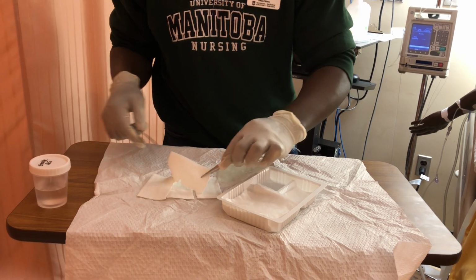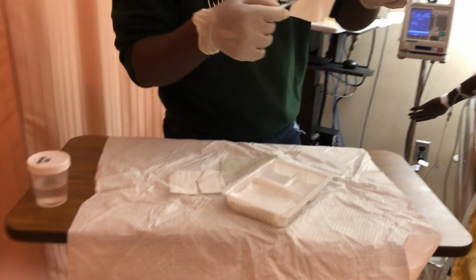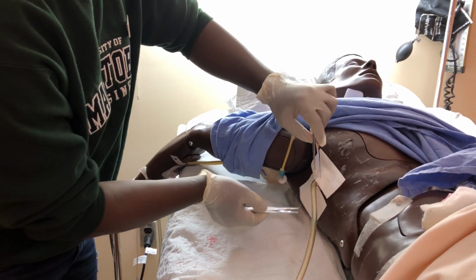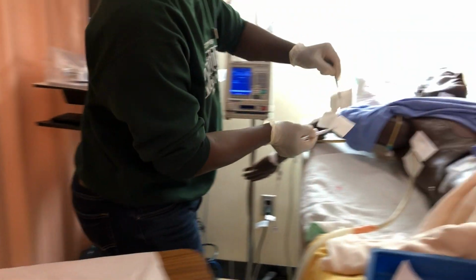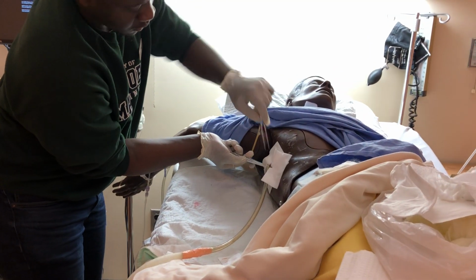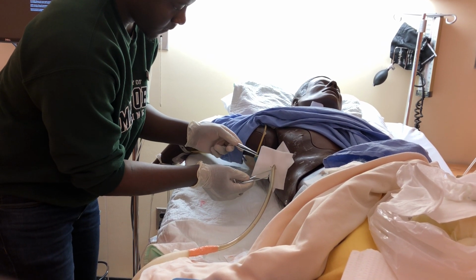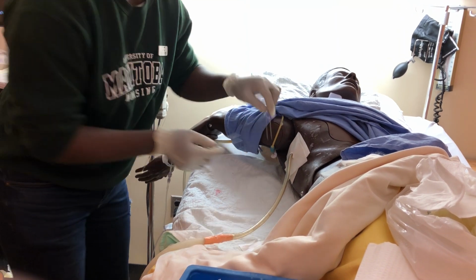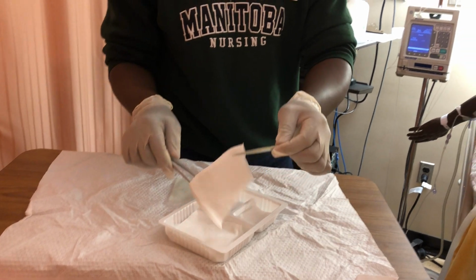And I also remember to bring normal saline just in case of an emergency, because when I checked the safety there was no normal saline in. And then I'll put in the gauze dressing, and put the other one in another direction to make sure it's fully occluded. And at this point I can just put a 4x4 on top of it.